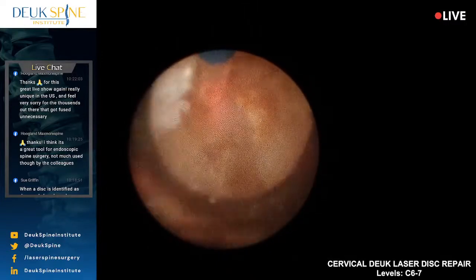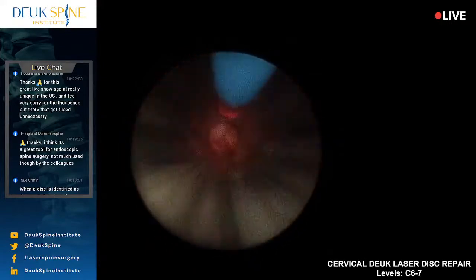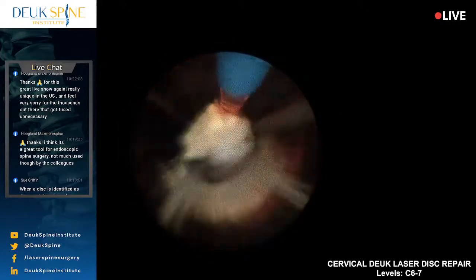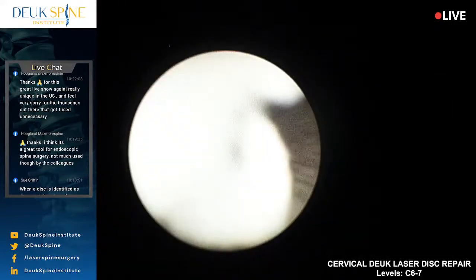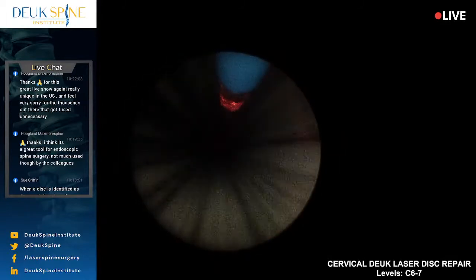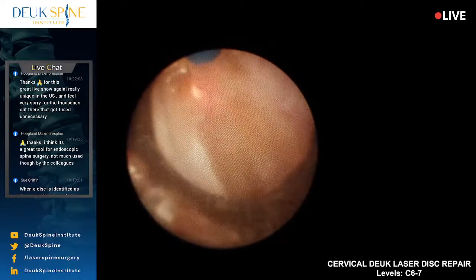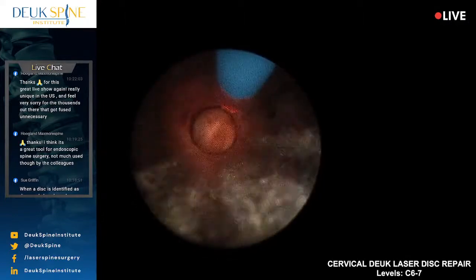That is the neuroforamen there. Let's turn. Are you able to see, Luis? Normally you put that for you to see, right? Yeah, well, I do it on bilateral approaches. Well, in the future you can have that one for you. Like that one there. But you always look on the top. I look at the top one. Oh, okay. I look at the high def. It's a much better monitor. So for me, I look at the top one. For some reason, I have better resolution on the ceiling mounted monitor than that one. So you can use that one.